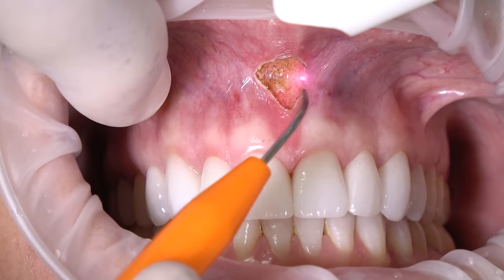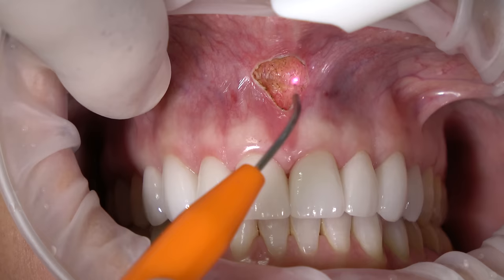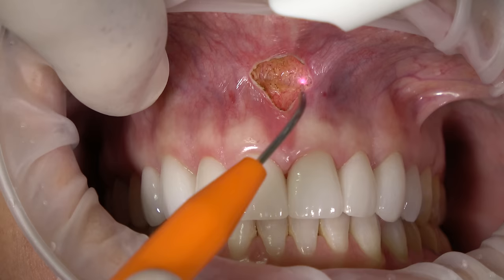We're going to go right to periosteum. Notice no bleeding. Post-operative discomfort will be at the injection sites only.